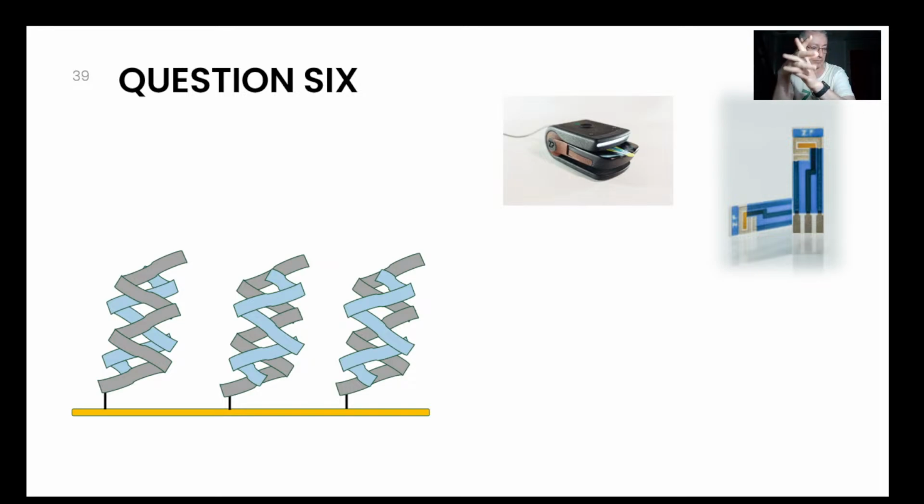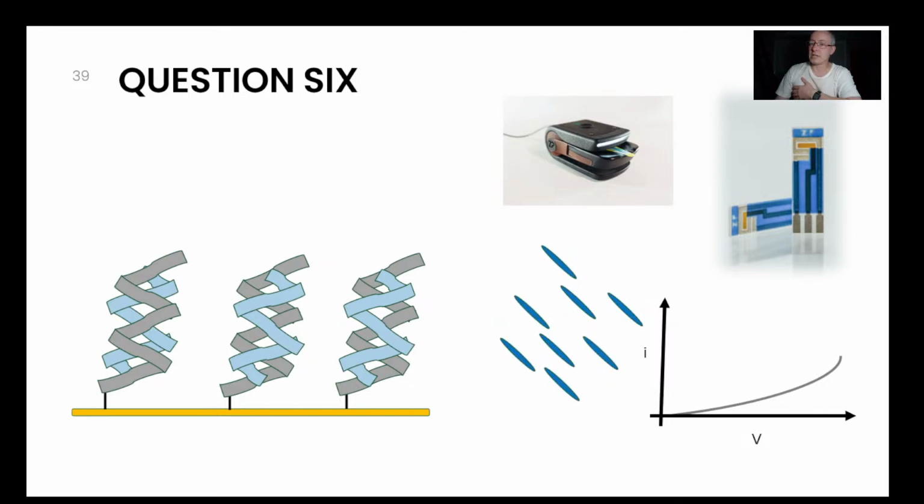I quite like molecular assays. The cleverness is that you can get specificity by the order of the bases. It clearly works; it's the blueprint of life. So thanks to nature again, I would say. Anyway, you get a specific hybridization, and if you want to know if that hybridization has taken place, you can do it in the presence of something like methylene blue, one of these dyes. There's a whole bunch of dyes out there that are electrochemically active.